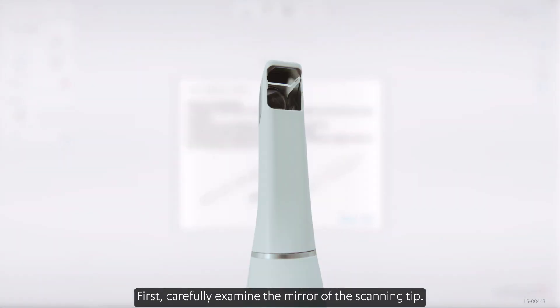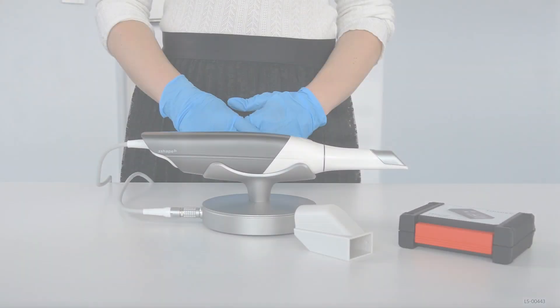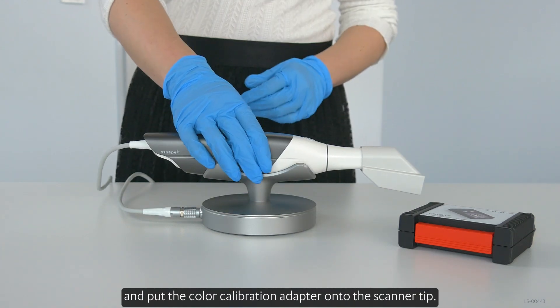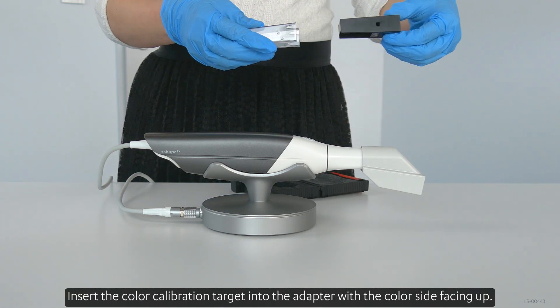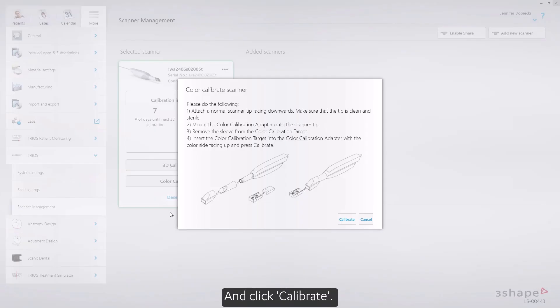First, carefully examine the mirror of the scanning tip. The mirror must be cleaned and sterilized, free of scratches, water stains, and dirt. Afterwards, attach the tip to the scanner facing downwards, and put the color calibration adapter onto the scanner tip. Insert the color calibration target into the adapter with the color side facing up, and click Calibrate.